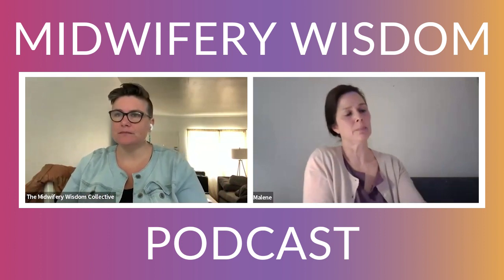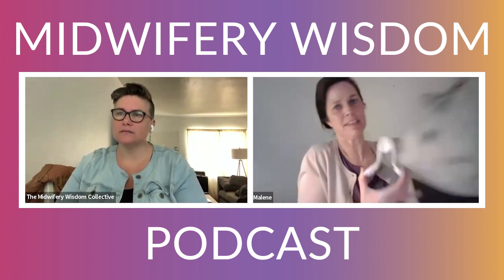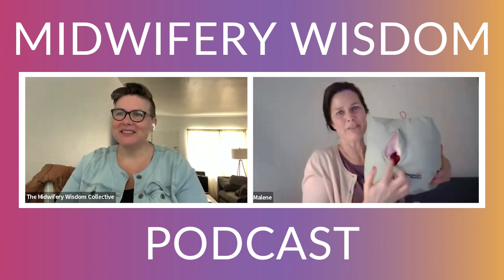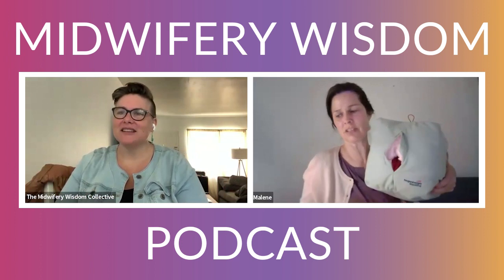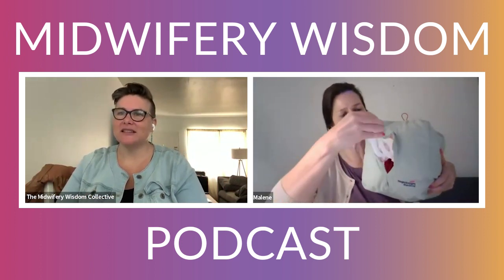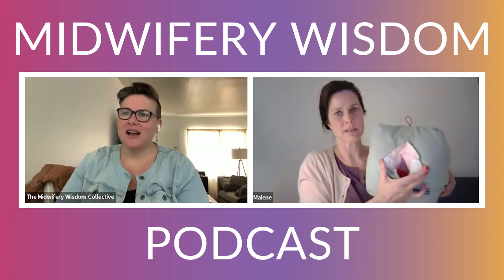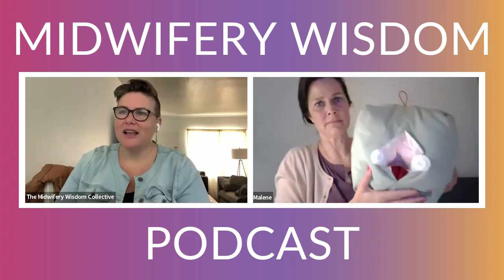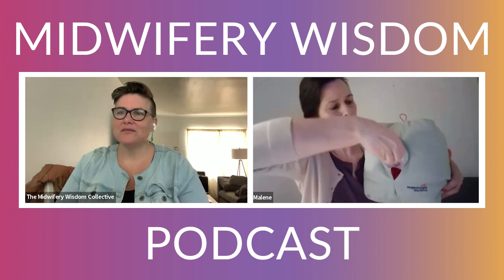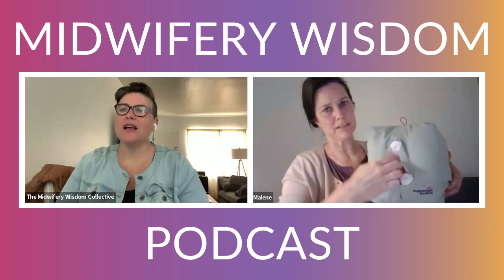Well, if you have a high vaginal tear, let me show you this little girl. Here we have a vulva with a tear at 6 o'clock. So you can use the Hegenberger like your third hand. You can place it where this one has a tear, straight down, so you can see straight in. If you have a high lateral tear, you simply put it in sideways. So it's where you would have placed your fingers.